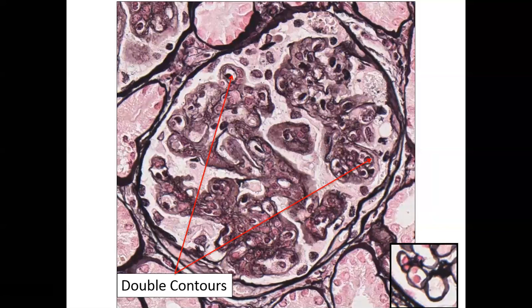So, yes, we have a question here. Yep. The top arrow at the end of that, yeah, so perfect. So the question is, here we even have the nucleus of a mesangial cell, and he is not within mesangium proper. He's out here in the capillary loop itself. So perfect. So this is a mesangial cell that's almost started to migrate out. And, you know, we have a couple of really great pictures of EMs of that type of lesion, but I get 20 or 30 glomeruli on a biopsy that I do histology on, and then when I get EM, I might only look at one glomerulus. So being able to catch that in the right section is really difficult. But yes, that's a good pickup, Josh.